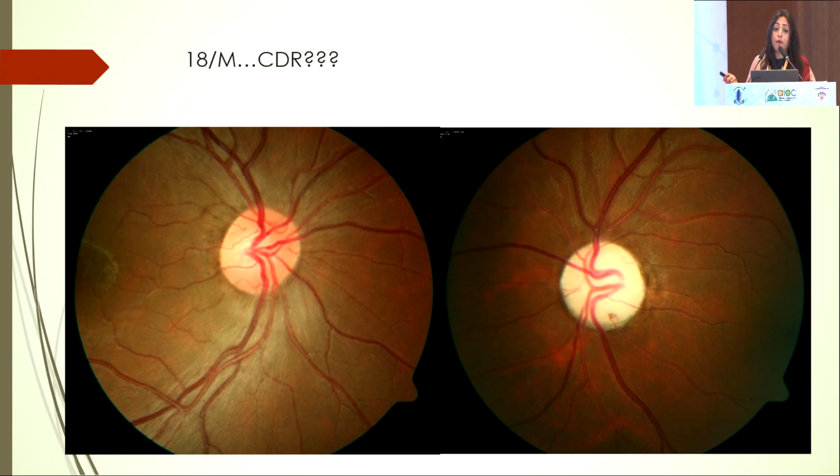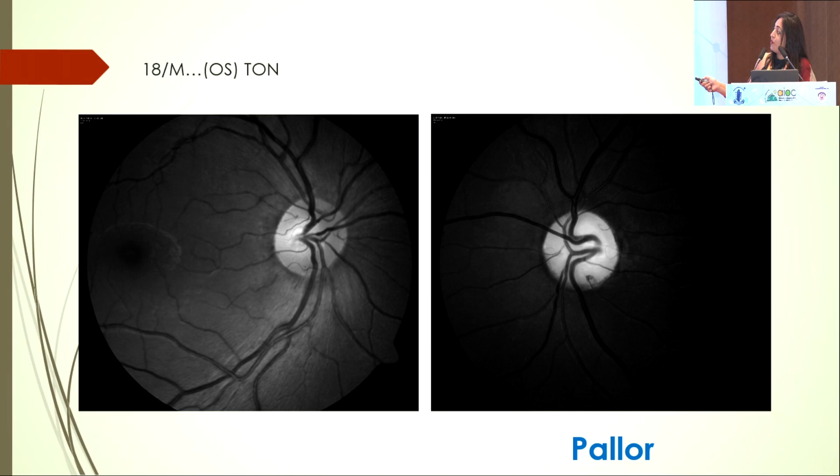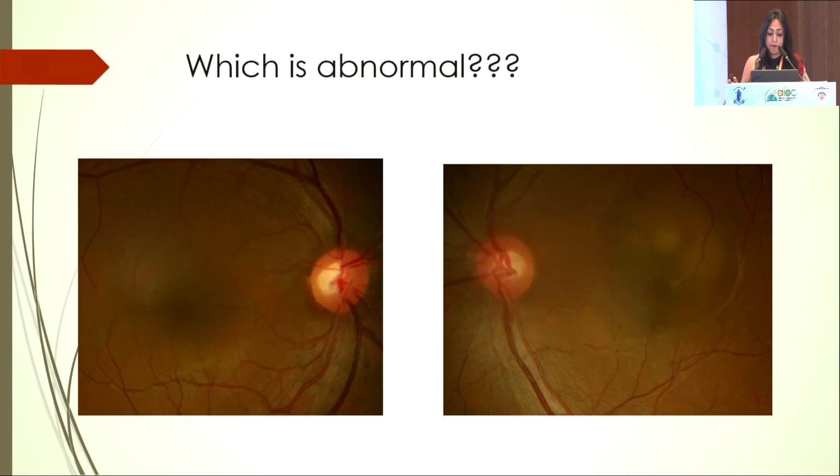This looks cupped. But is it really cupped? It's not cupped. It was actually a case of traumatic optic neuropathy. This is actually a pallor, disc pallor, no cupping.